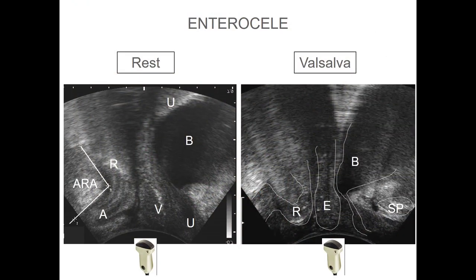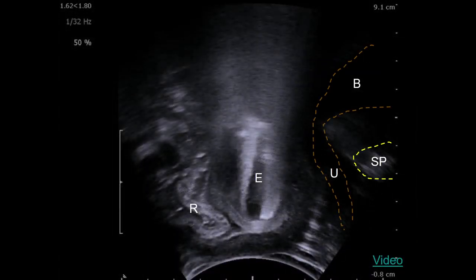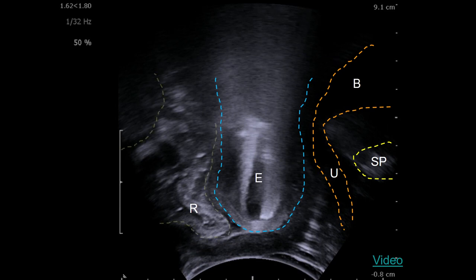Enterocele — small bowel entering between the rectum and the vagina. Look at this image: symphysis and bladder are there, this is the enterocele, and this is the rectocele. Today with Andreas we had a lady where we saw enterocele and rectocele — she had a hysterectomy. Similar cases.